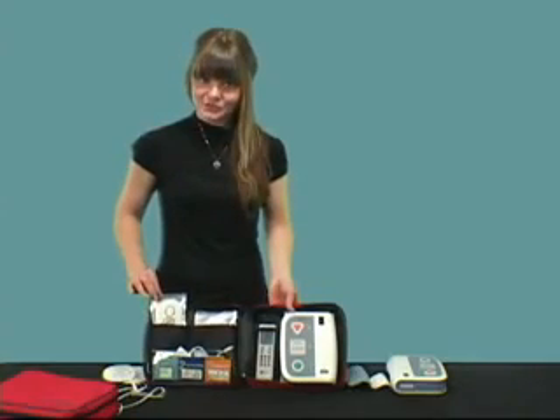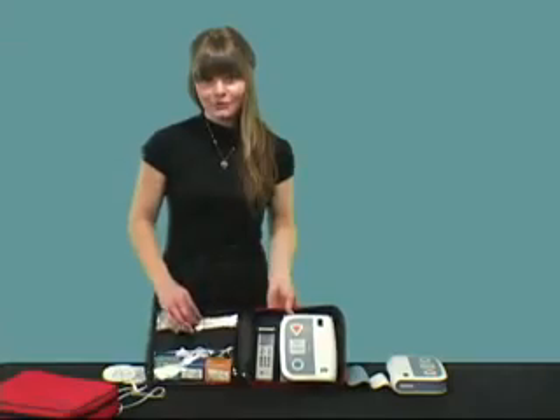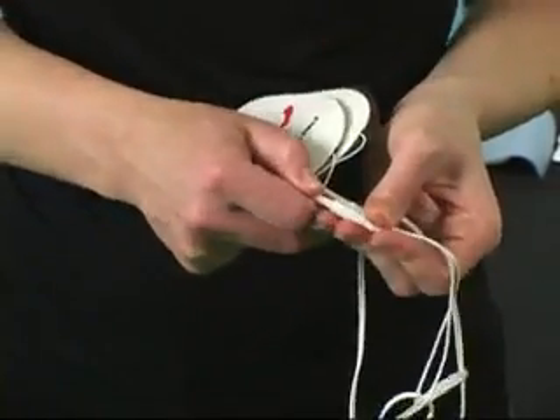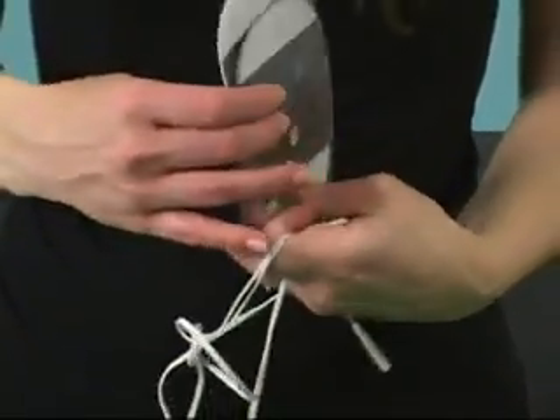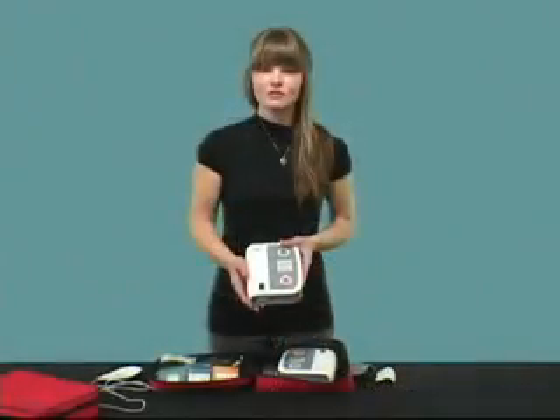Both the pediatric and adult child training electrodes come with a cable that connects their electrode pads. When it comes time to replace worn out electrodes, you only need to replace the electrodes themselves and not the entire cable. The adhesive on these pads works well with almost all training mannequins.